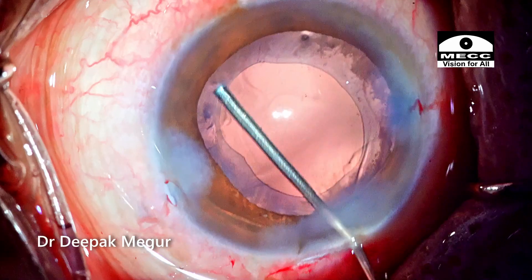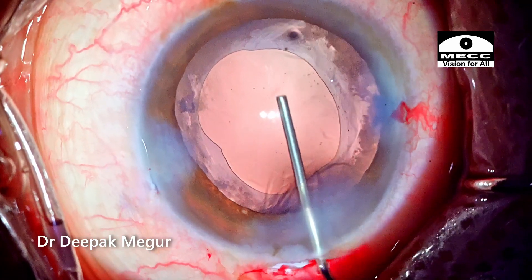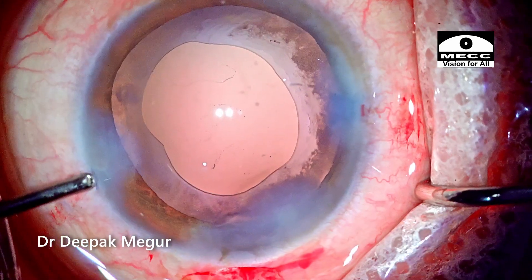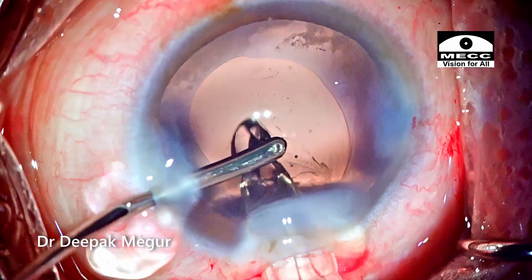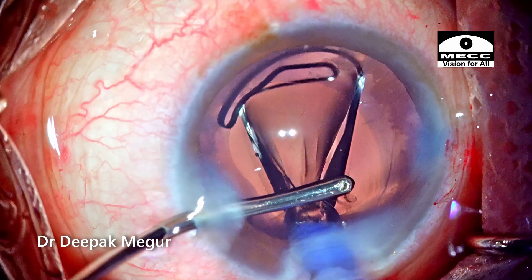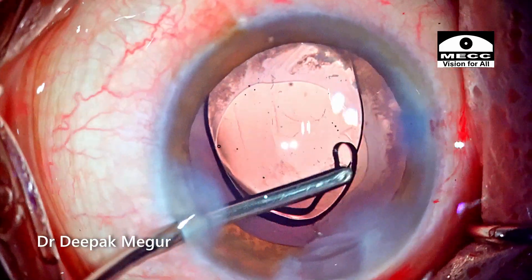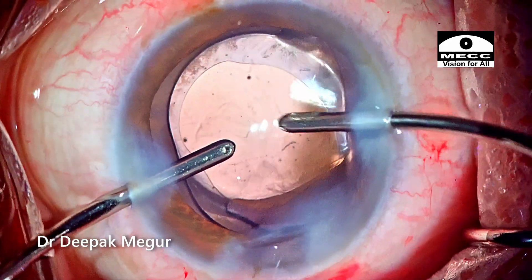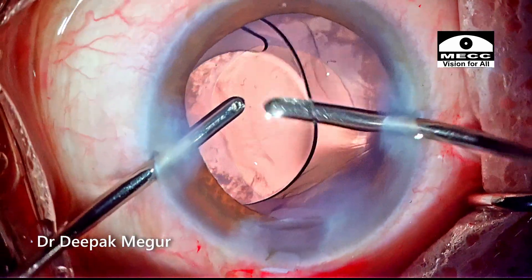A little bit of lens debris sticking onto the capsule is being flushed. Once done, I'm inflating the bag with OVD and a single-piece hydrophobic lens is implanted into the bag. The OVD both in front and behind the lens is then aspirated out.